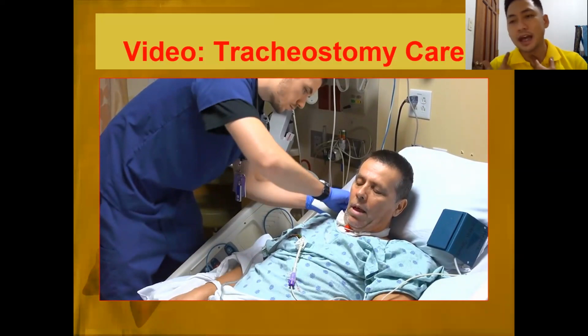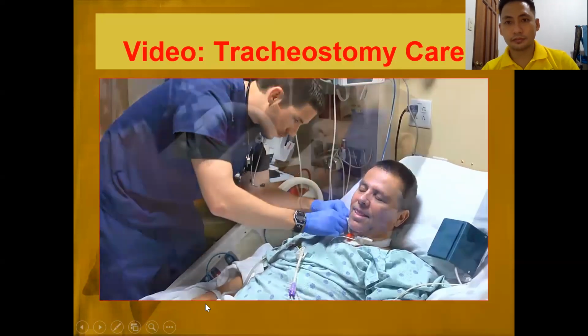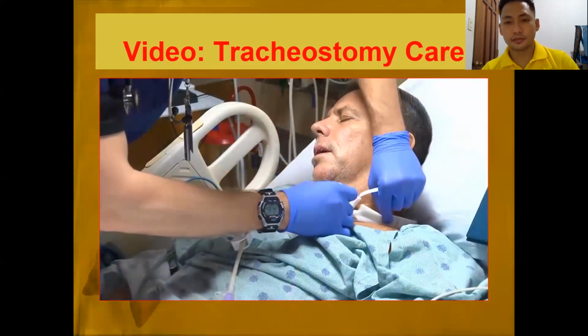Pero kung ikaw lang isa, don't remove it yet. Replace it with new one. Kasi para secure siya while you are changing the collar. Kasi baka accidentally ma-pull yung tracheostomy. Leave the old tracheostomy tube holder in place until the new device is secure.